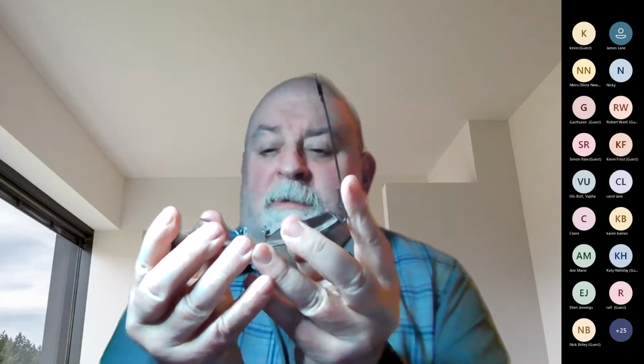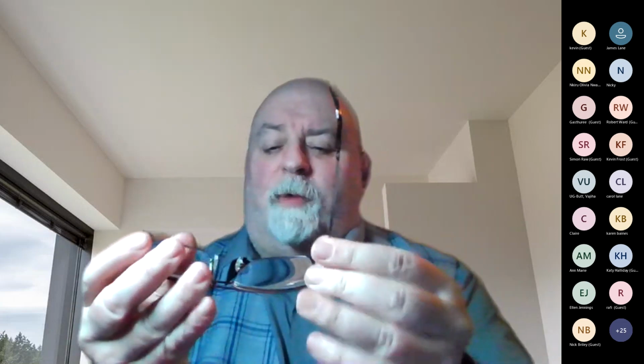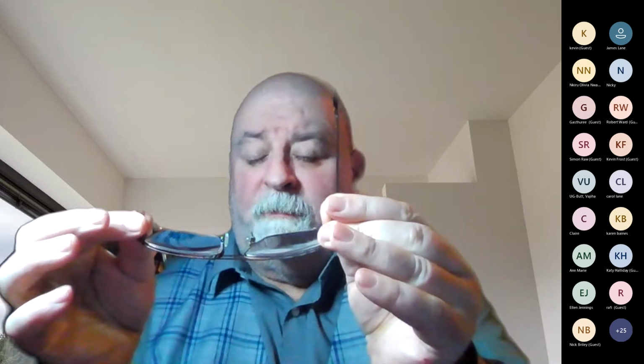But then we've got the lens tilted. Now this is a lens that's tilting along the horizontal, and that means it's going to induce a horizontal cylinder. Now, I'm going to try not to break my specs, but if I then twist it like this, I've now got a face form angle showing there that's at about 10 degrees instead of what I normally wear it at, which is 5.